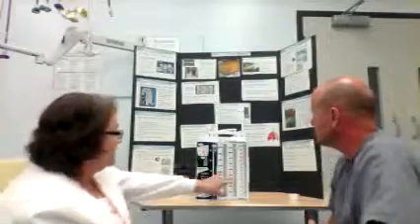So Bodie, what would you do if you walked the patient, you came back and you noticed you had 180 and it was bright red? Okay, what does bright red blood indicate? That's a new bleed. A newer bleed. So if you ambulate a patient, or even if you're just monitoring a patient who's laying in bed and you notice a sudden increase in your chest tube drainage, especially if it's bright red. Hey, Mr. Smith, each shift has been having 20 cc's of dark output or clear, serous output. Now all of a sudden, wait a minute, I'm up to 160 and it's bright red. Assess the patient, notify the physician, because that's a change. That could be an active hemothorax or a new bleed inside that chest cavity. So those are good points.